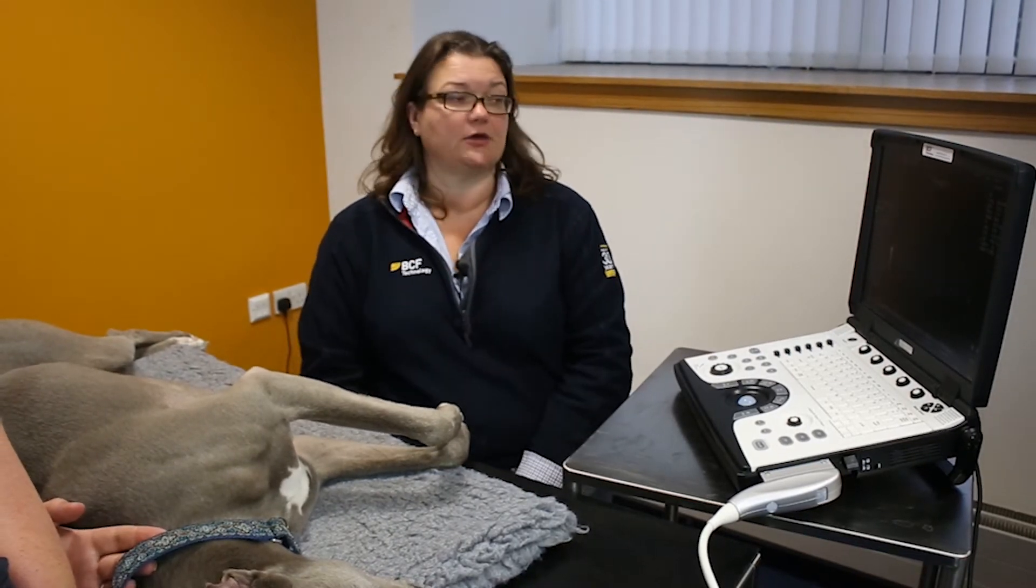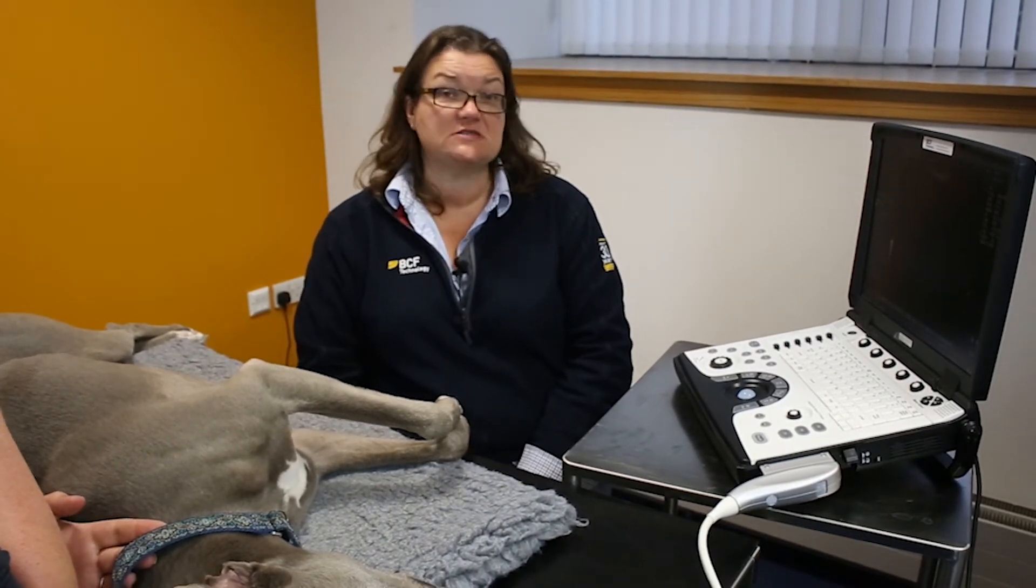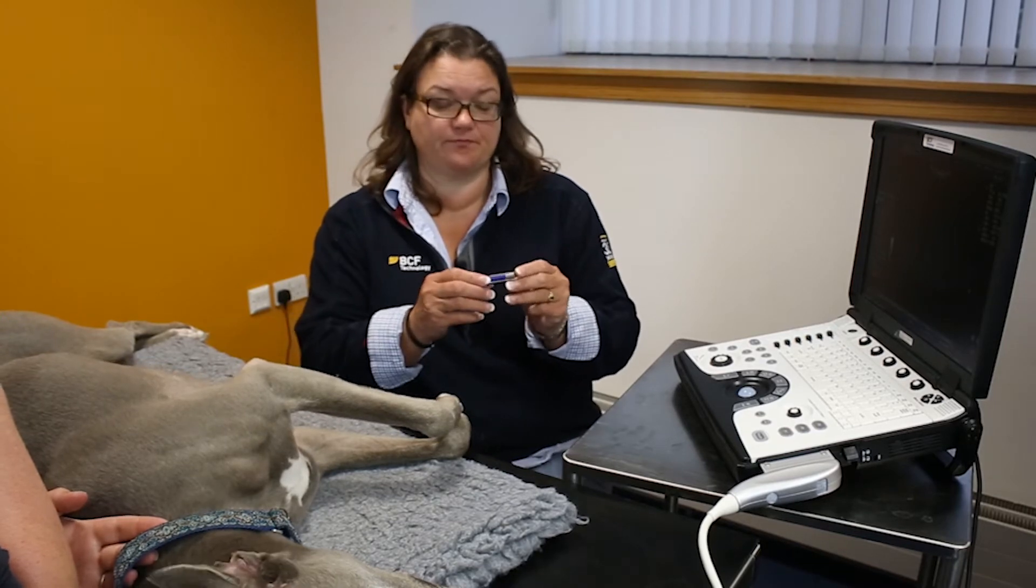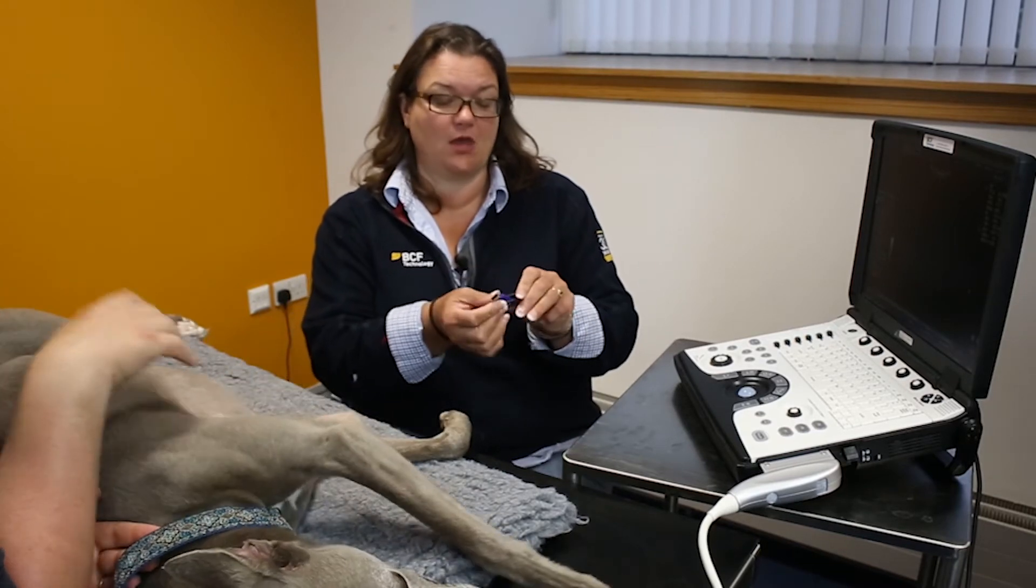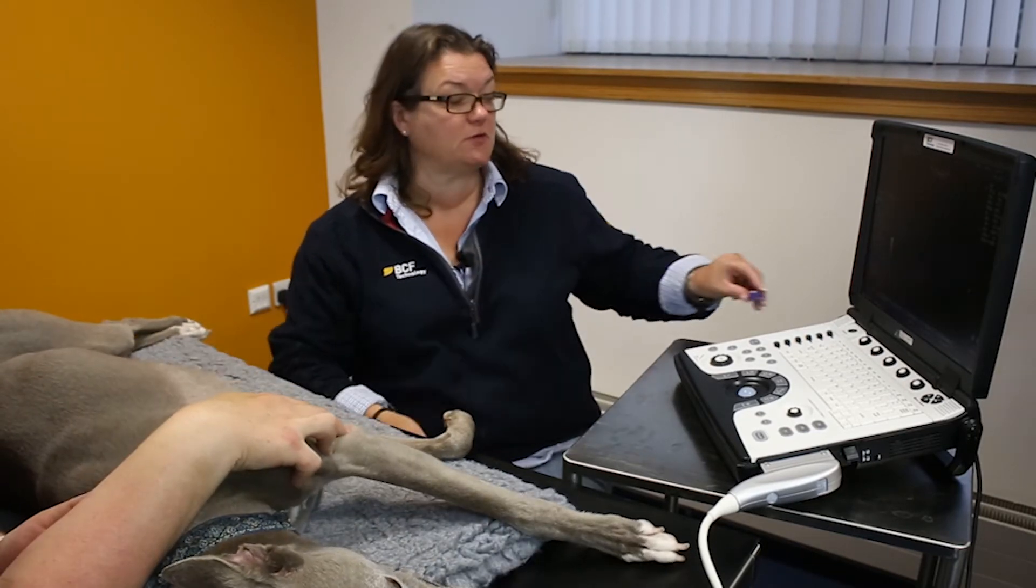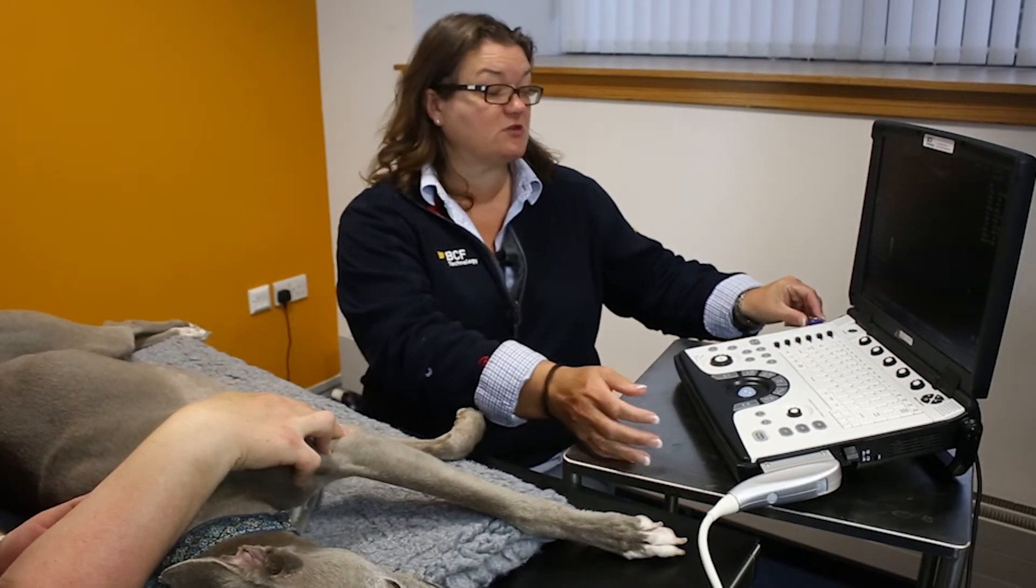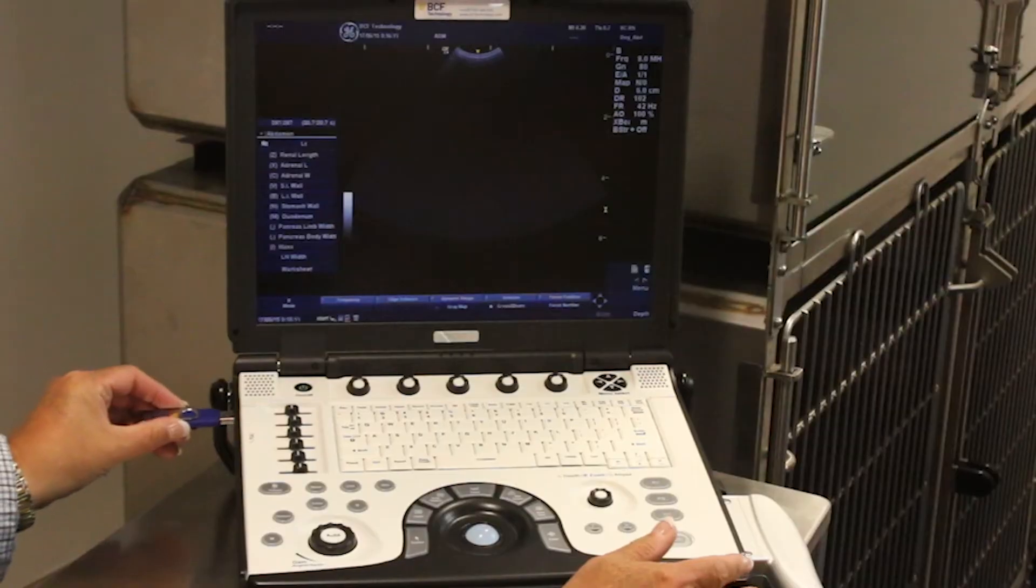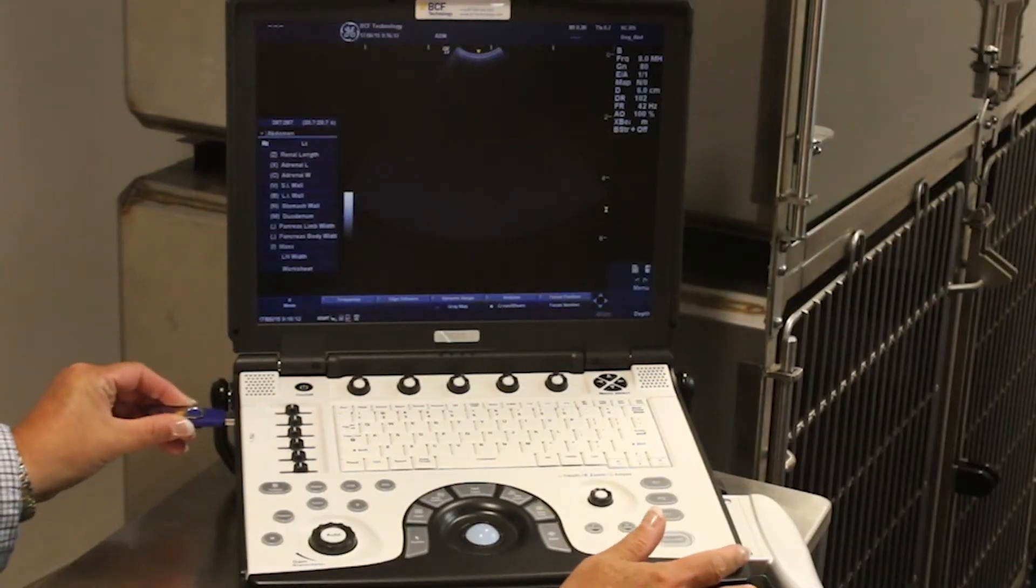Right, now let's look at how to get images off the machine. For this, we're going to need a USB stick, and I'm going to put the USB stick in one of the serial ports on the side of the machine, here.